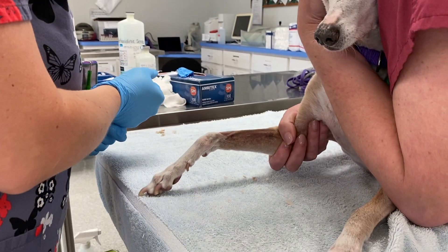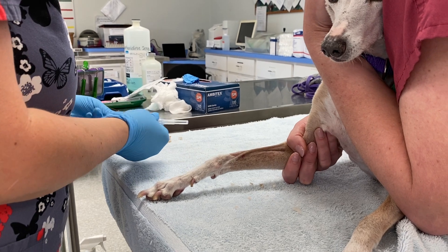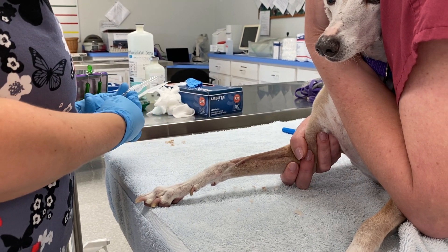Now your restrainer is going to hold off the vein. They're going to put their thumb over the top of it and roll the veins outward.